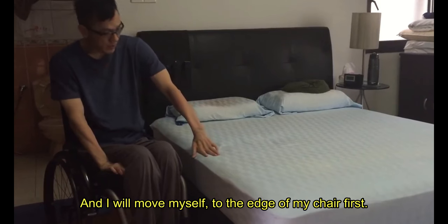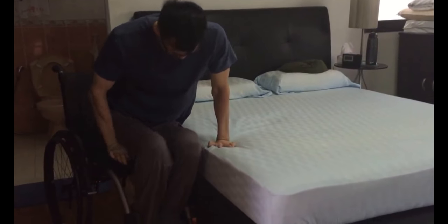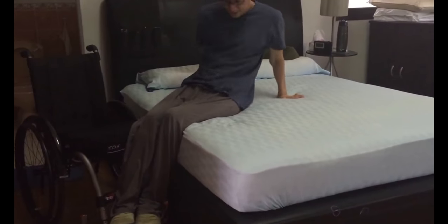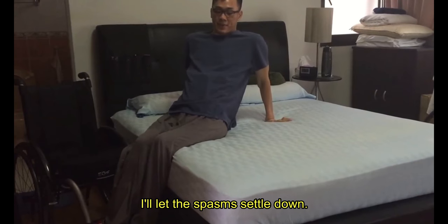I will move myself to the edge of my chair first, placing one arm on the bed and the other on the seat of the wheelchair. Lifting himself onto the bed. I will let the spasm settle down.